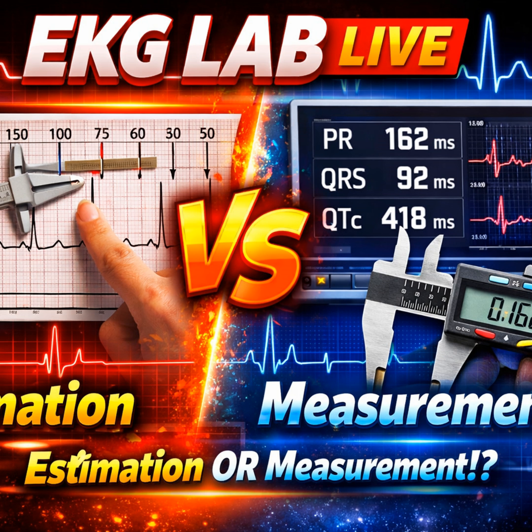The hyperkalemia debate. Exactly. You look at the strip, you see tall peaked T waves. Your box counting tells you the amplitude is high. But can you diagnose hyperkalemia, high potassium, just by measuring the height of the T wave? While specific levels of serum potassium cannot be perfectly linked to unique EKG patterns, the peaked T wave is a critical indicator that requires immediate verification. Verification through context. The source explicitly states you can't just look at T wave magnitude. You need to know, does this patient have renal failure? And, crucially, did they just eat a bowl of guacamole? The dietary intake is relevant, yes.